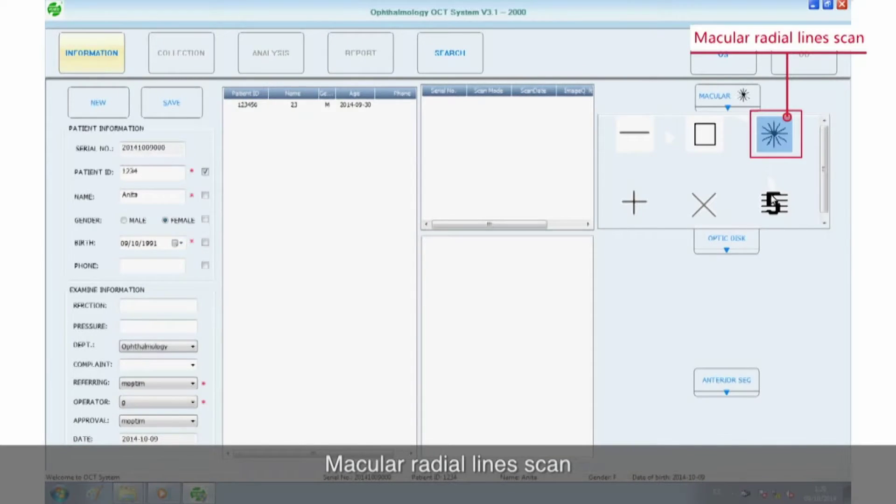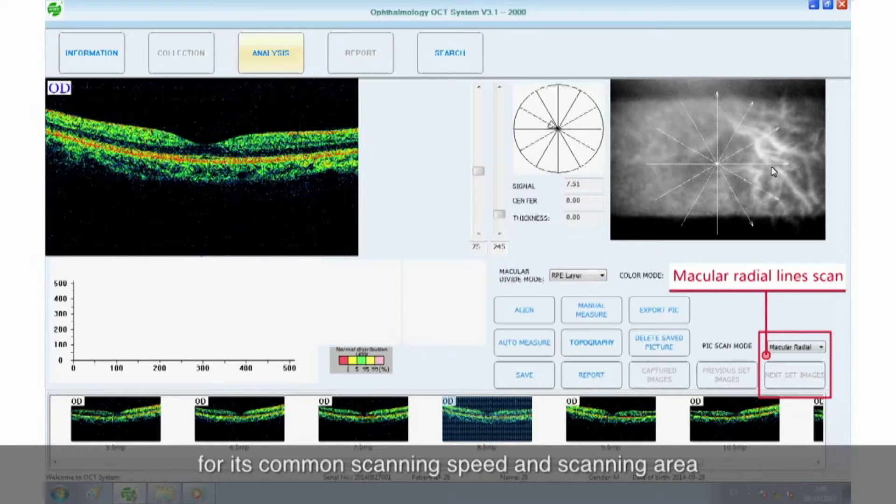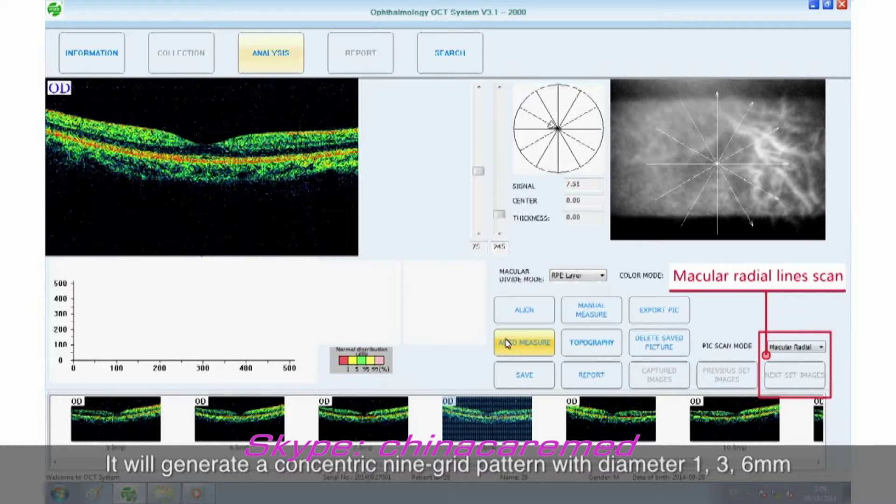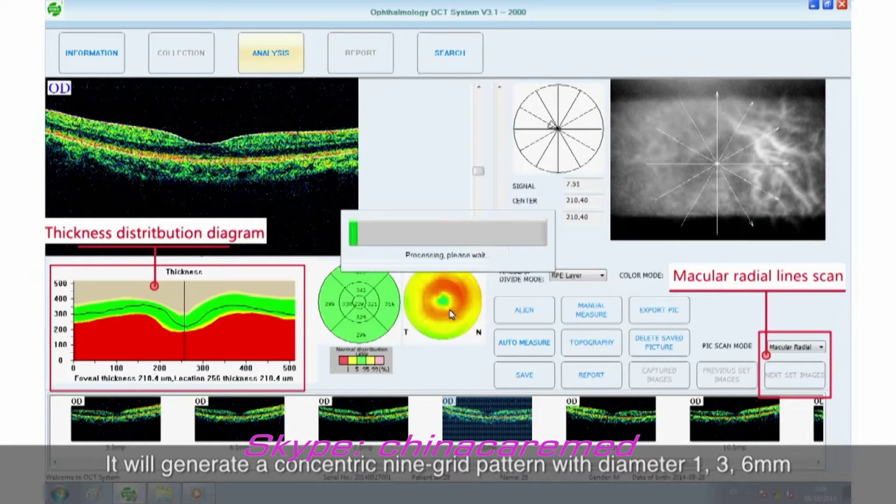Macular radial line scan. We suggest to use this mode at first time for its common scanning speed and scanning area. It will generate a concentric 9-grid pattern with diameter 1, 3, 6 millimeters, and get average thickness value and topographic map of each region.